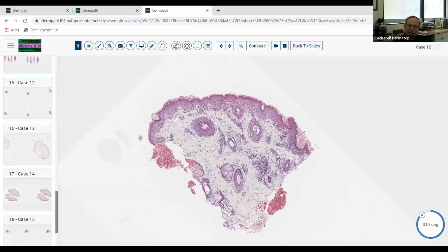When you can put into that category, there's a relatively few number of diseases that can give you that pattern. So you start thinking of differential at low power, say, well, okay, lupus, maybe some kind of photodermatitis. The photodermatitides tend to give you a deep involvement, maybe a photoexacerbated drug reaction.